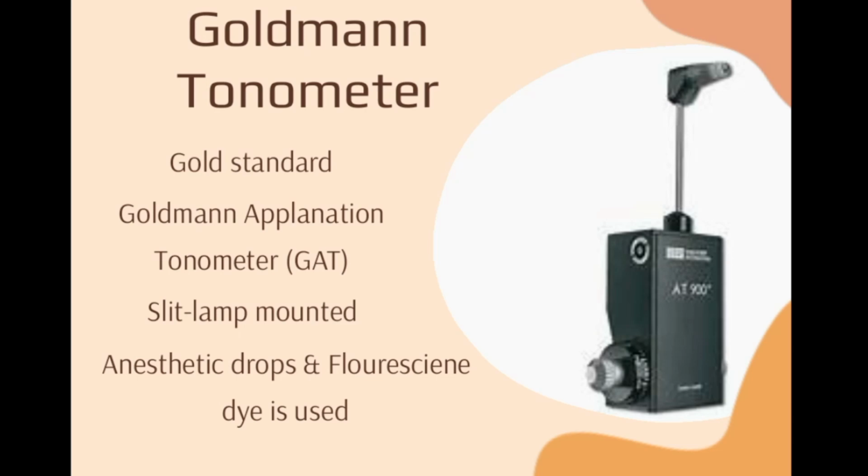So when you touch the cornea, it will give you sensations, and in response to those sensations the eye will blink continuously. So it can cause damage, and to reduce that blinking you need to anesthetize the eye. Also for pain, so that when you touch the cornea, you don't feel any pain or you are senseless at that point. That is why you need to anesthetize the eye.